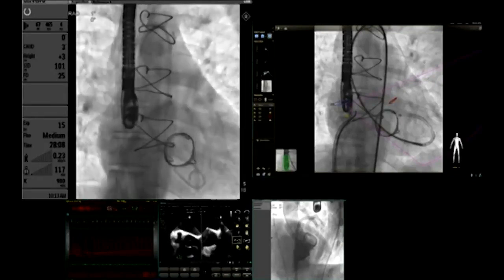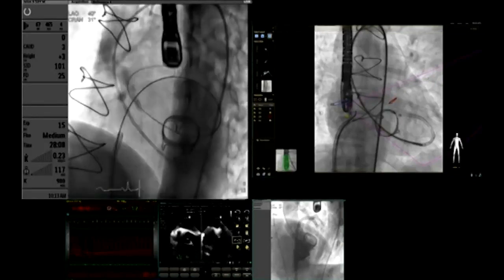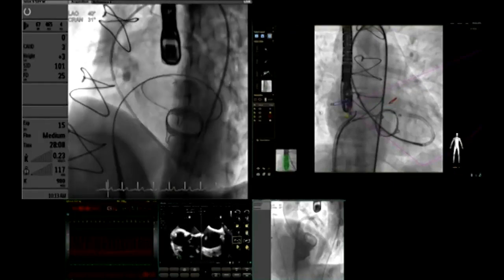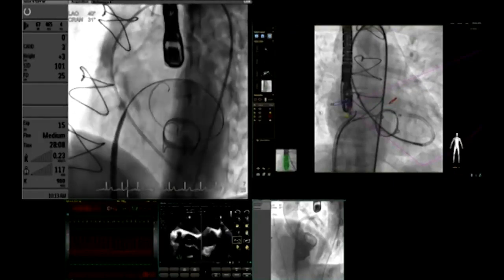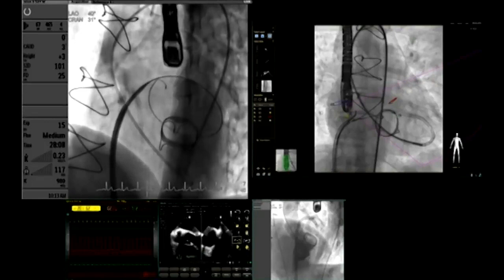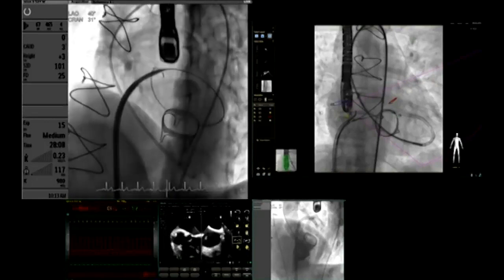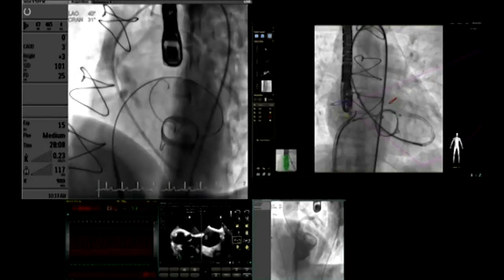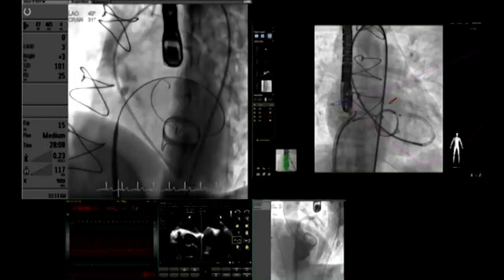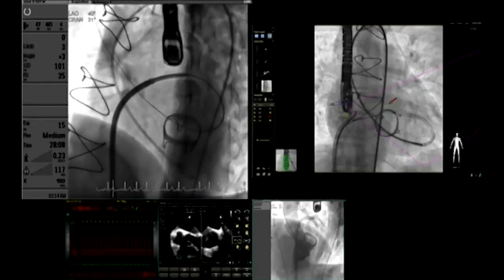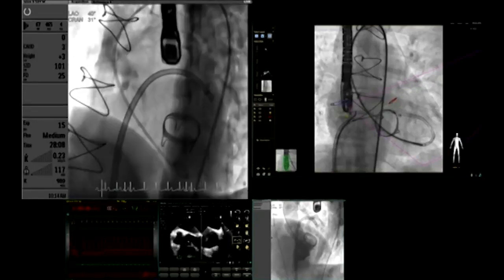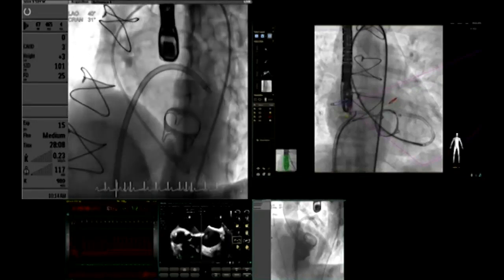We then advanced the left ventricular catheter. This is the transeptal sheath going in over the guidewire. The sheath on top is the Agilis sheath.